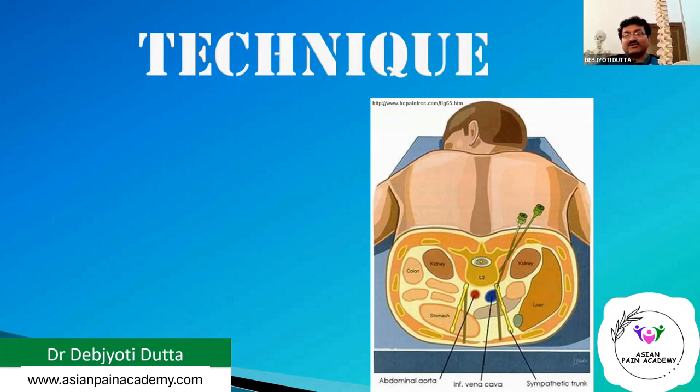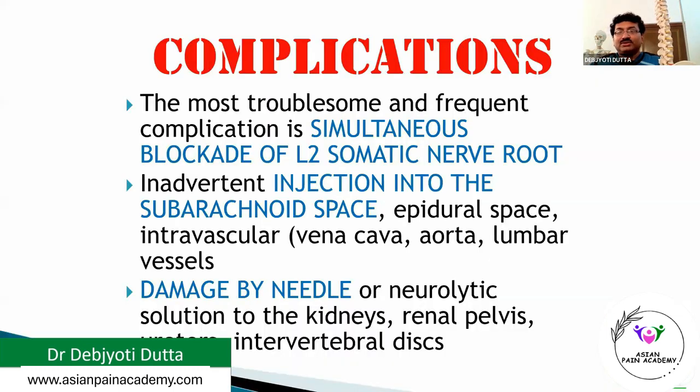If you are doing a radiofrequency ablation, then at this point, go for the stimulation, both sensory and motor. Here, as it is mainly a sympathetic block, you may not find any movement. Actually, if you are getting any movement in the legs, that is dangerous. So we are not expecting anything. Once we are done and we are seeing that leg muscles are not moving, then we can give local anesthetic first. Then we have to do the lesioning at 80 degrees Celsius for 90 seconds. And in radiofrequency, we do it at all 3 levels. So that was the technique.